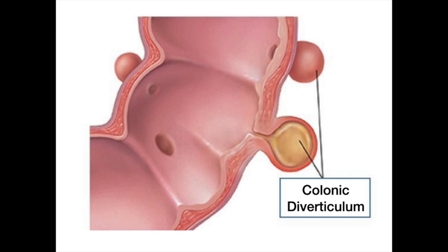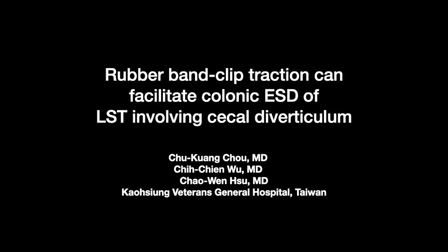Endoscopic dissection for laterally spreading tumor involving the secant diverticulum is challenging. Here, we would like to present how we use rubber band clip traction to facilitate the entire procedure.